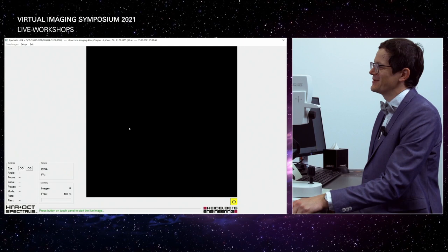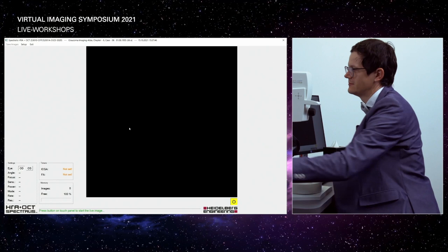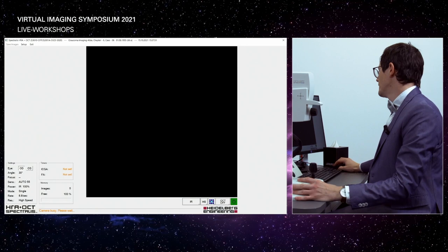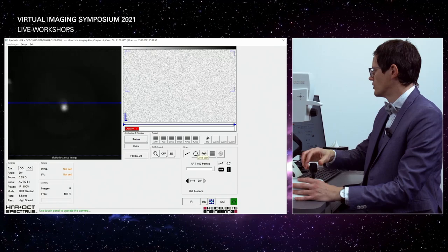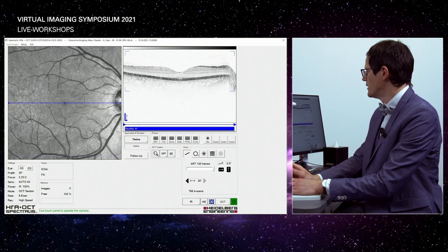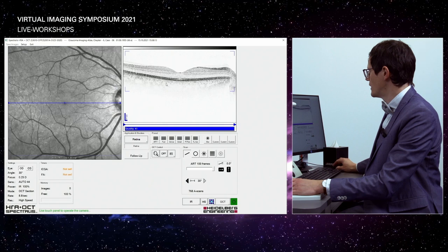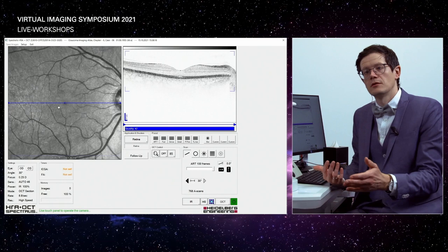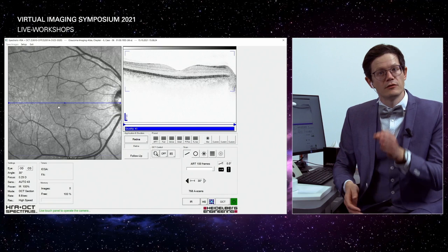That's the time I ask the patient to come in front, align the table, and check that the patient is as comfortable as possible. We start the camera and the OCT — as always, start by positioning the bright circle in the middle, come closer to the patient's eye, and try to illuminate both the fundus image and the OCT image as well as possible.